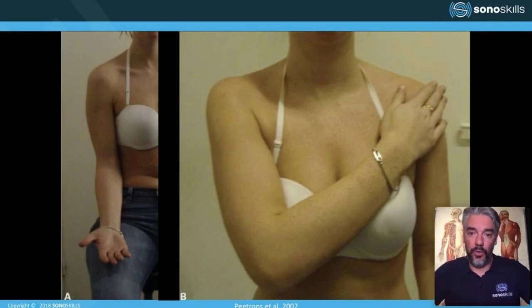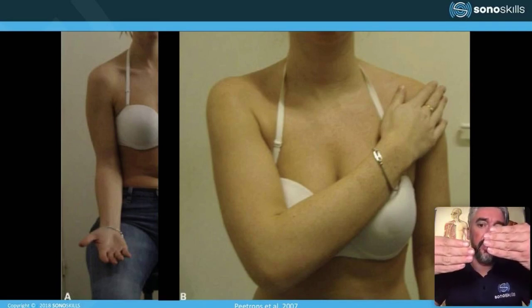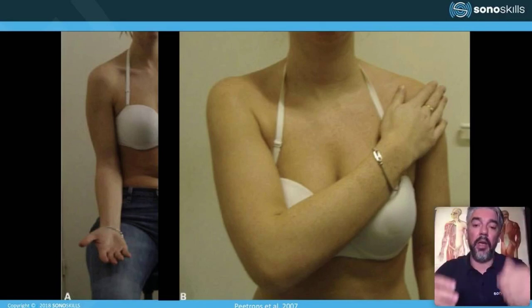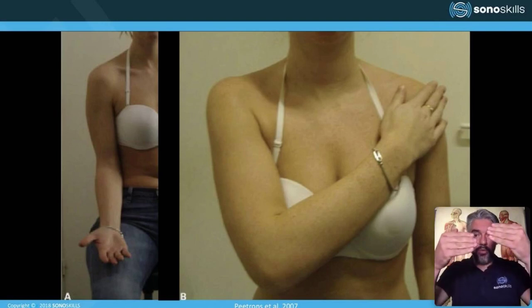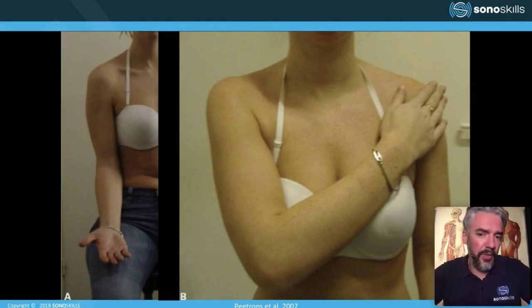What we actually do is we scan the AC joint, and the AC joint needs to be stable. If there's instability, you can see a large movement in this trajectory, especially at the end. If they go back and then relax, then you can really see this movement. So there can be a certain flexibility. That's okay, but it should definitely not be unstable. So that's important to know.